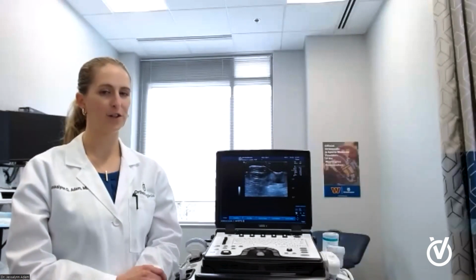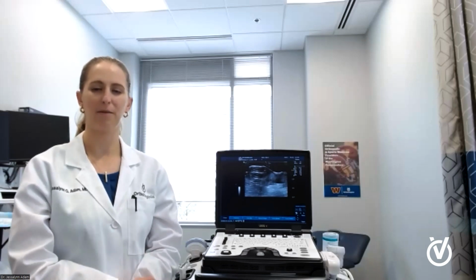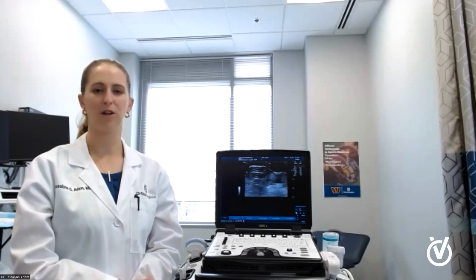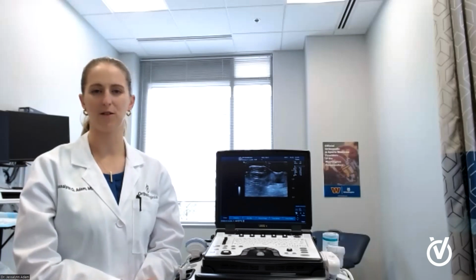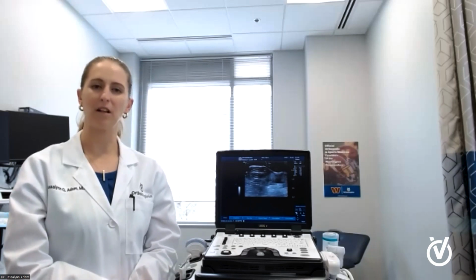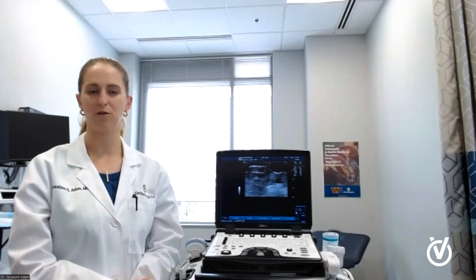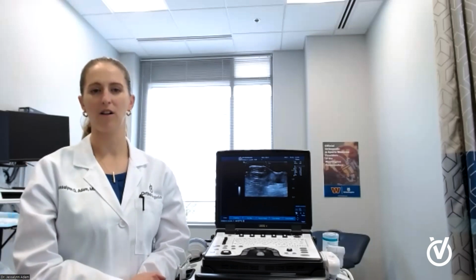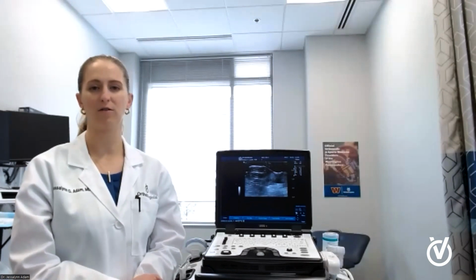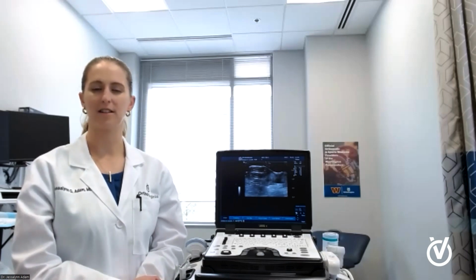Thank you. What can the ultrasound detect in the rotator cuff area? So the ultrasound can do a fairly comprehensive evaluation of the shoulder. I routinely look at the biceps tendon, both joints of the shoulder, as well as all four of the rotator cuff muscles and tendons at their attachments. I can even see parts of the labrum and some of the ligaments that can be involved in a frozen shoulder. So provided the person is able to move their arm, I can evaluate all of those very well. And ultrasound has great resolution for picking up things like rotator cuff tears or biceps tendon injuries.